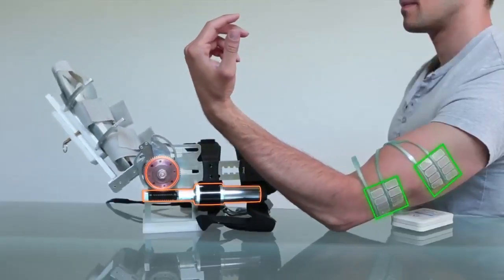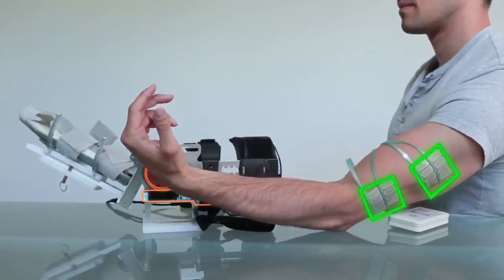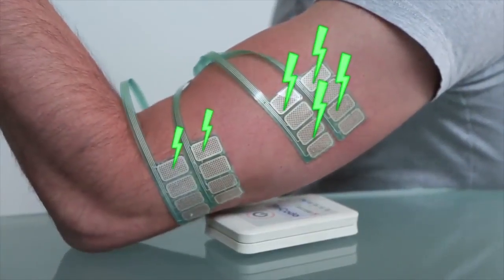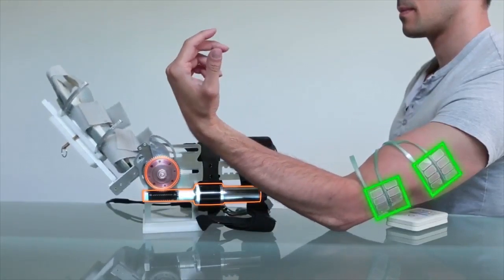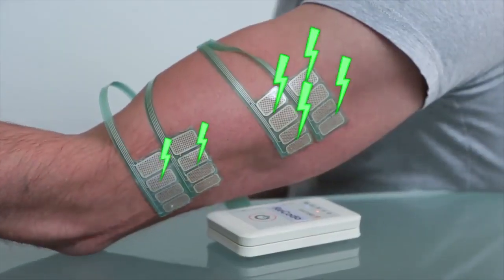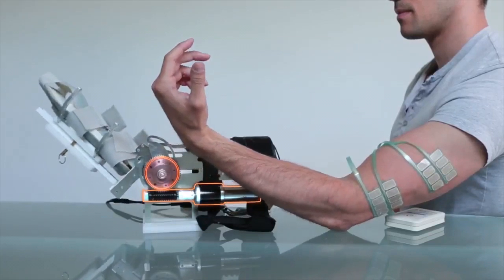Functional electrical stimulation is applied to encourage triceps activation and boost the exercise effects. The analgesic effect achieved by electrical stimulation allows patients to perform exercises more effectively.